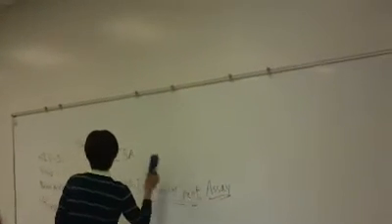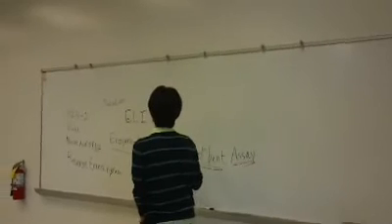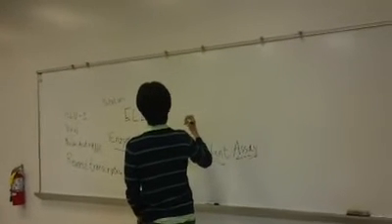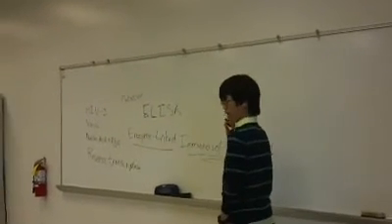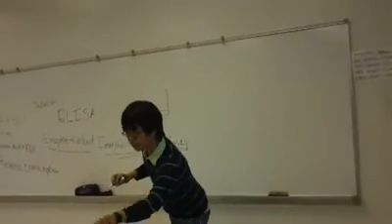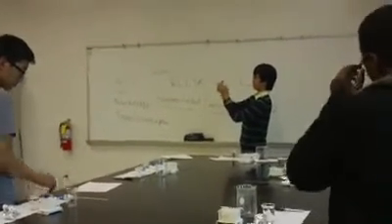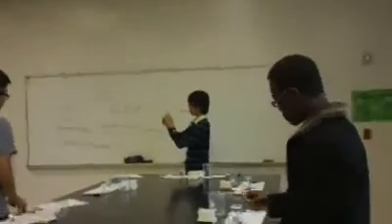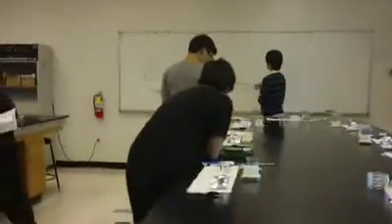And the reason ELISA reactions are so important is because they're used as a diagnostic test. And here's how we're going to be doing this. If you remember, you have your little microtiter plates, right? And within each you've got these little wells. These wells are actually going to be holding the HIV antigen. And I'll just draw it in this way.